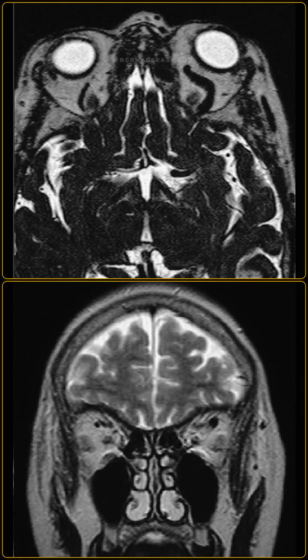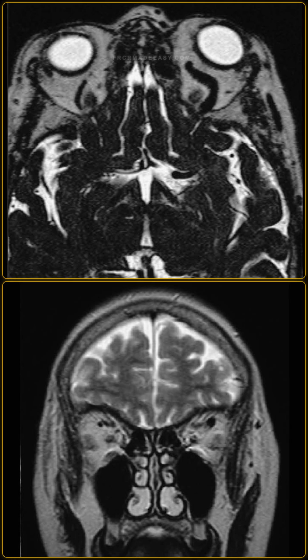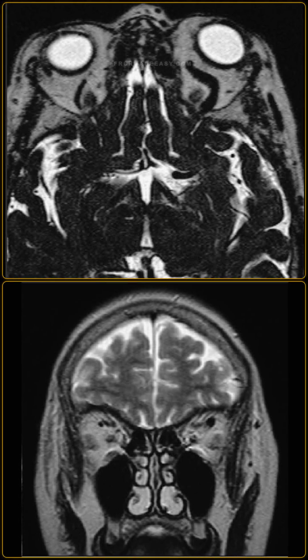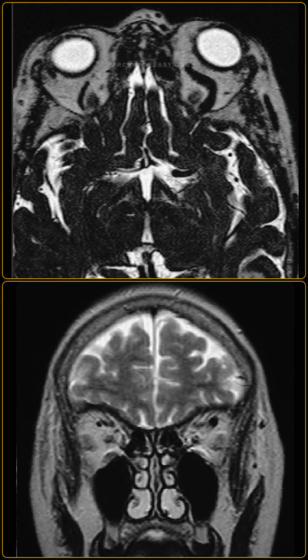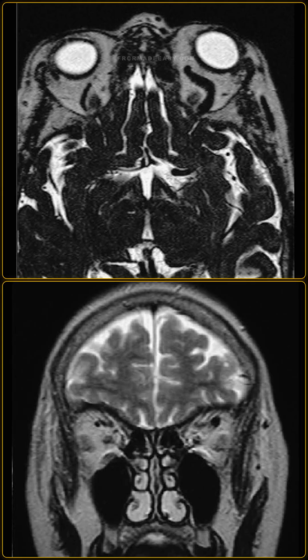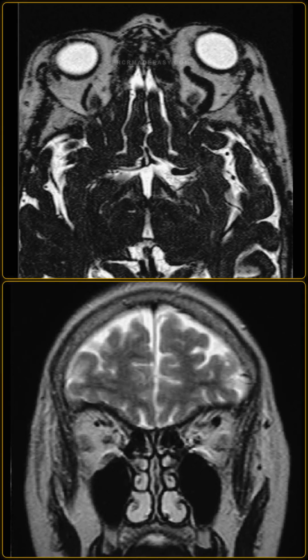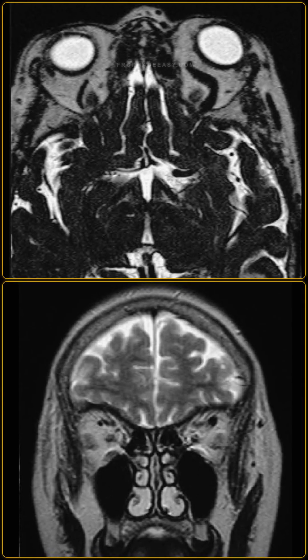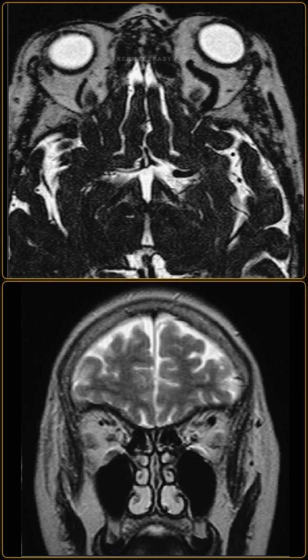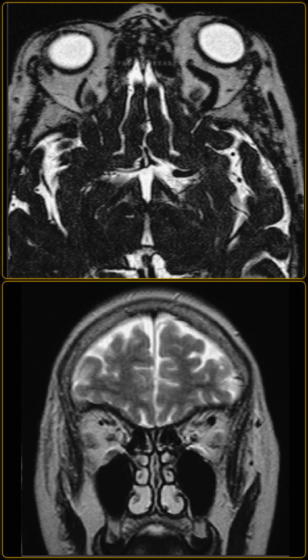What is the diagnosis, and what is the differential for a dilated superior ophthalmic vein? The diagnosis is a left-sided caroticocavernous fistula, which represents an abnormal shunt between the internal carotid artery and the cavernous sinus. The differential diagnosis for a dilated superior ophthalmic vein includes cavernous sinus thrombosis, isolated superior ophthalmic vein thrombosis, orbital pseudotumor, Graves' ophthalmopathy, and an obstructive retroorbital mass. A caroticocavernous fistula is distinguished by the presence of fast, arterialized flow within the vein.